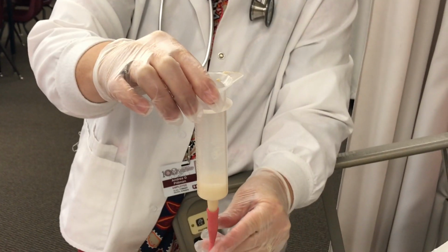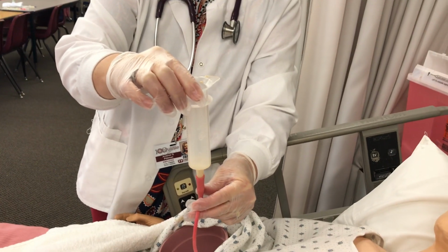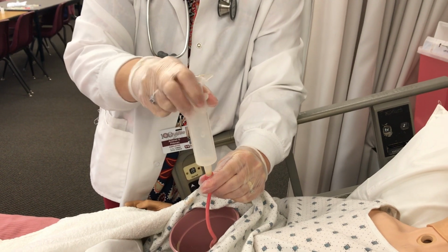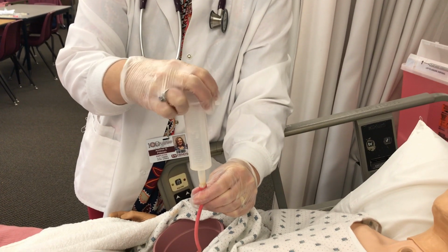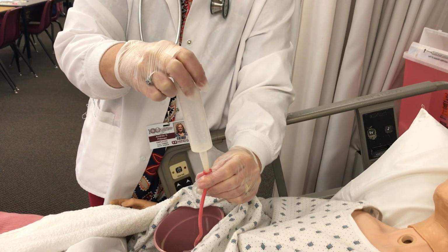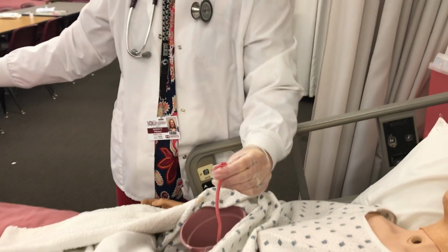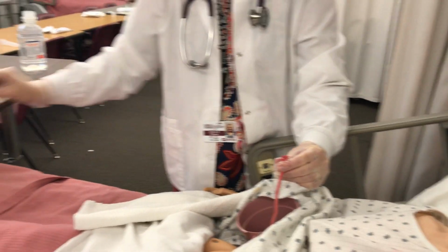So you can kind of see it going to gravity, and you want to make sure you catch it real quick before a lot of air gets in there. Whoop, got it. All right, so we've had 50 cc's of water before, 100 cc's of our feeding, and 50 cc's of our flush. At this point, we can recap our PEG.